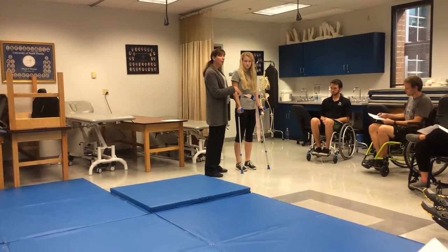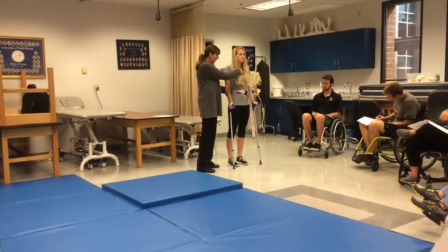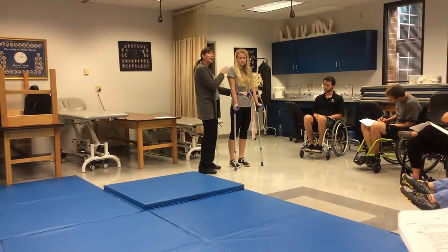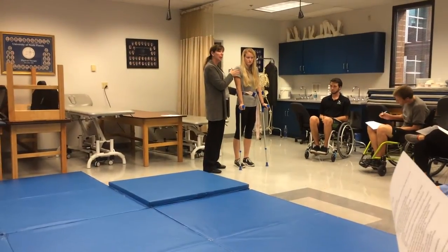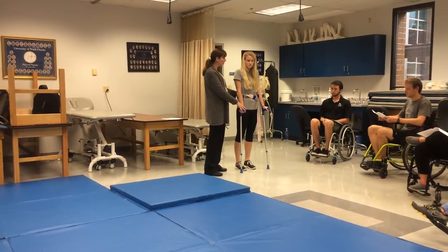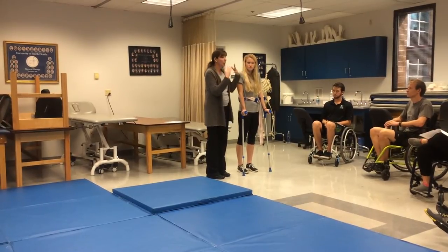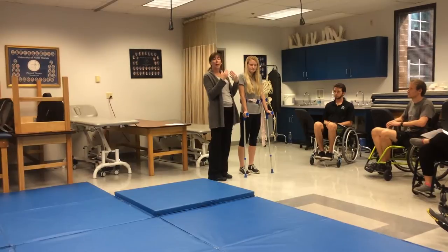She needs good knee range of motion, and how much dorsiflexion? Ten degrees. So she's bringing her weight line to gravity, going through the shoulder, posterior to the hip — she's hanging on those Y-ligaments for stance stability. That's where we want her to be. She has full upper extremity strength and some abdominal strength. If her shoulders come forward, she has nothing to prevent her from coming back up.